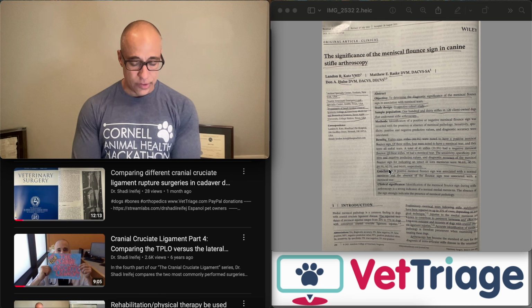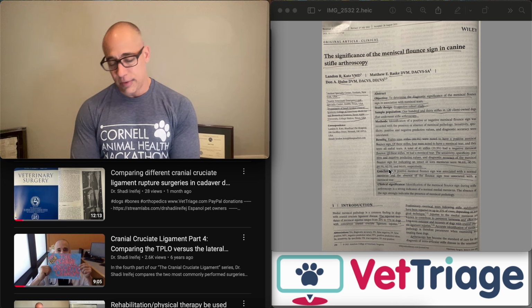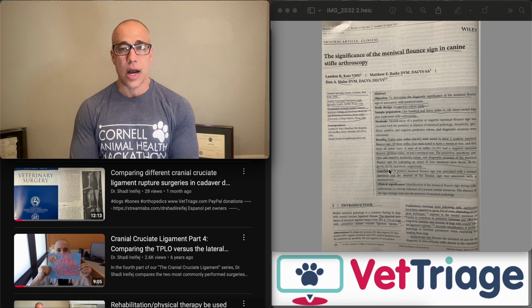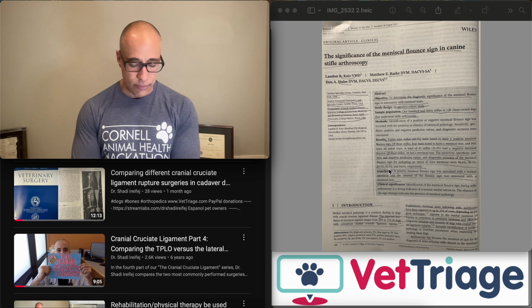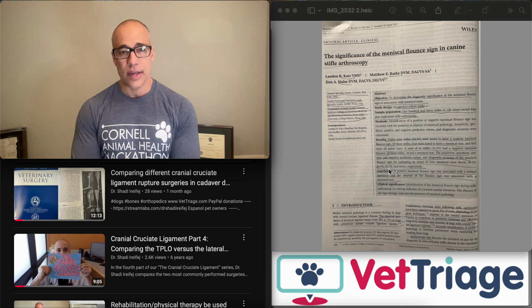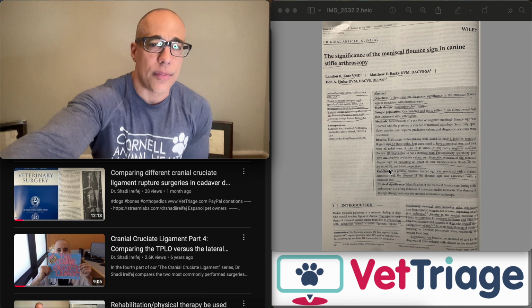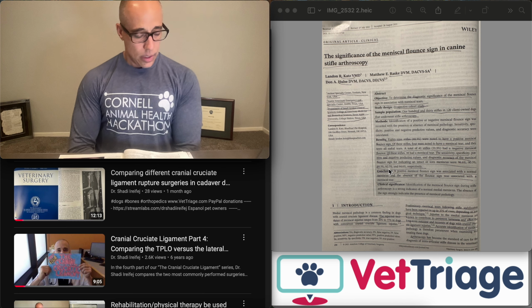Conclusion: a positive meniscal flounce sign was associated with a normal meniscus, and the absence of a flounce sign is associated with meniscal tear. Just so you know, those numbers are very high. To have 90% or more of sensitivity, specificity, etc. is very, very high. Normally you'd have a high specificity but a low sensitivity, or some kind of balance. So these are really high, which tells me either this is a ridiculously accurate test for meniscal tears, or that the study is flawed and they don't have enough animals, which is typically the case.